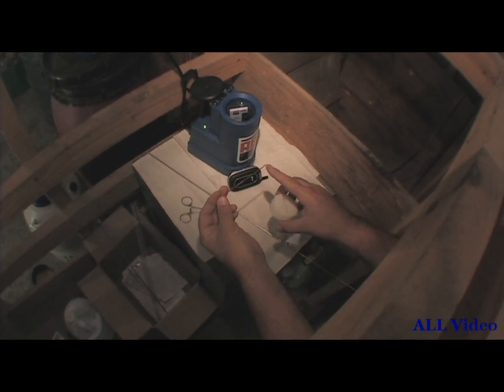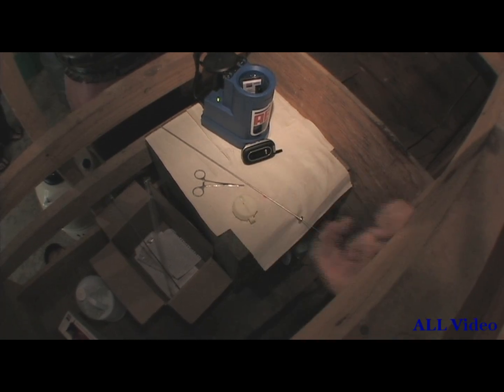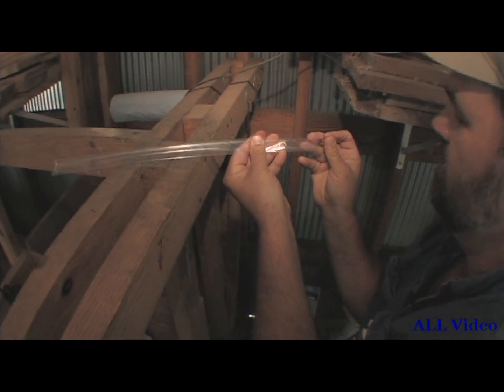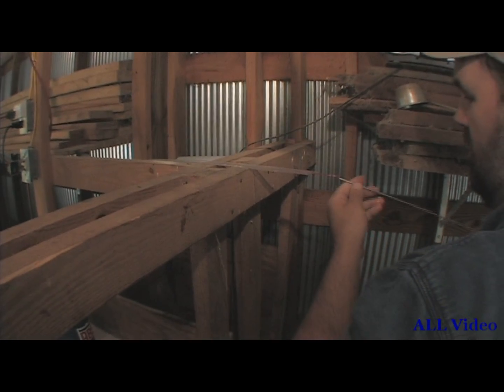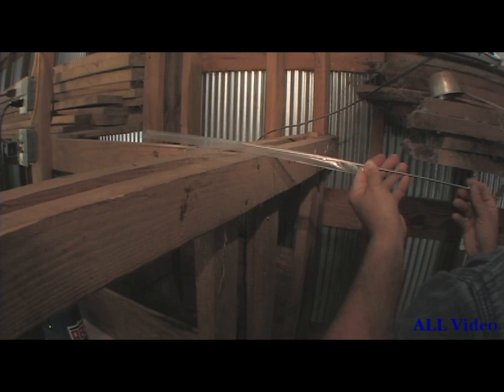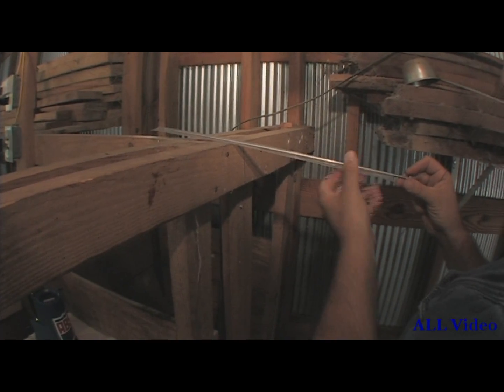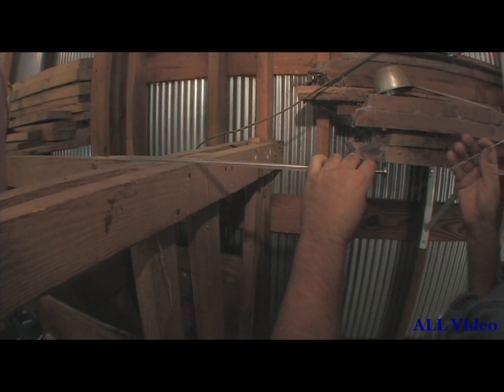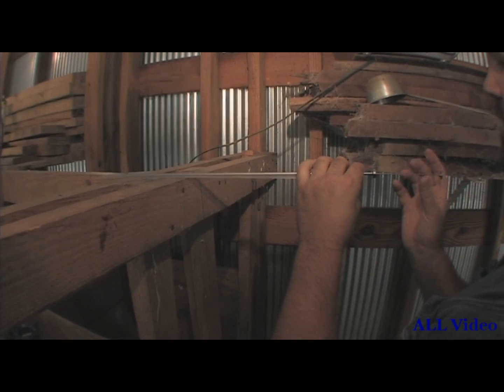Pull the straw out right here. I've got corks on this end — this end's the closed end, sealed and crimped off. You stick it in and cut it. That end's open now. You put it in this side, up to that blue part, and push it all the way in. I've got my metal syringe. Pull the stopper back, start your syringe right here, and plunge it in. It goes all the way up like that. There are little tiny threads right here — you can just thread that on so it doesn't come back on you. Put your stopper in, and be careful because you'll push the semen out. You feel a little slight stop and you just quit. We felt it right there.